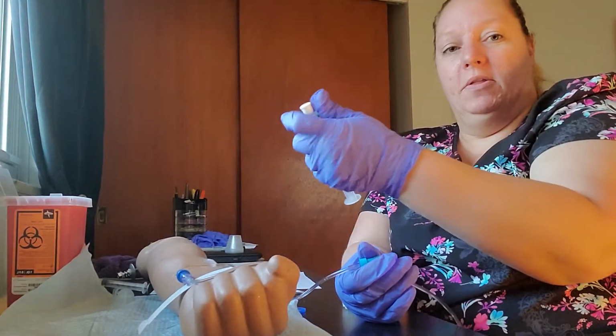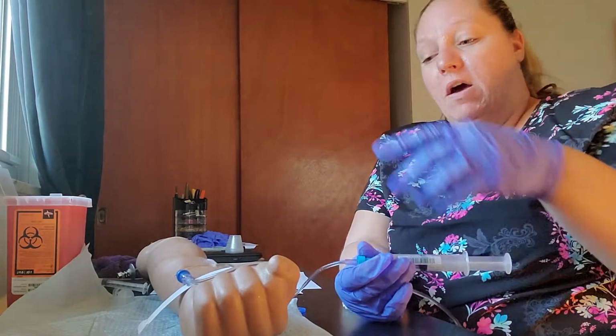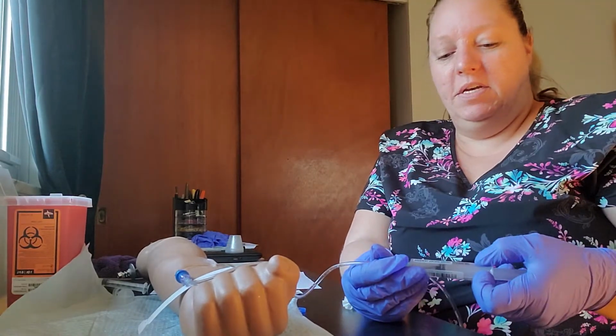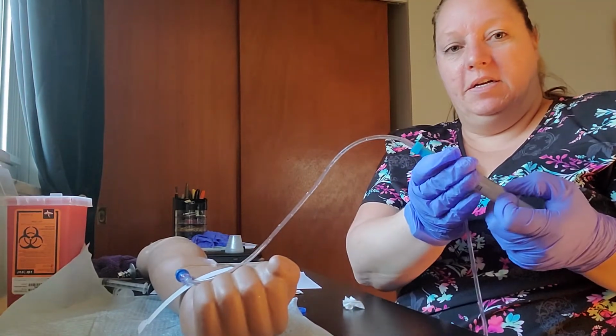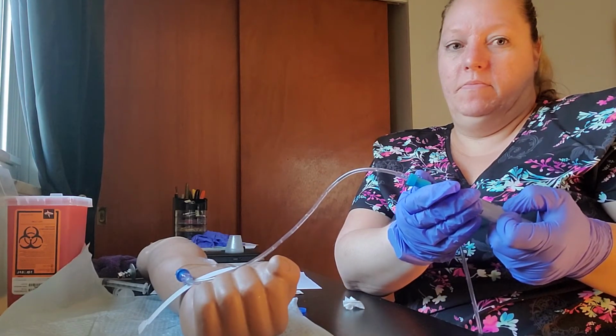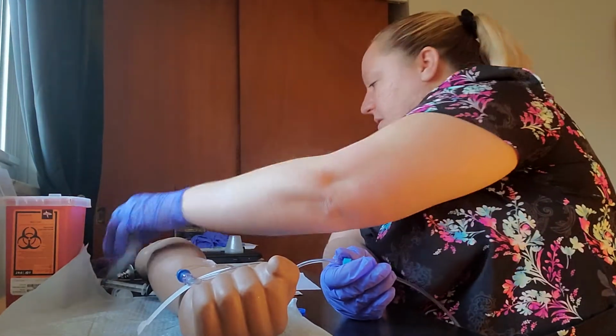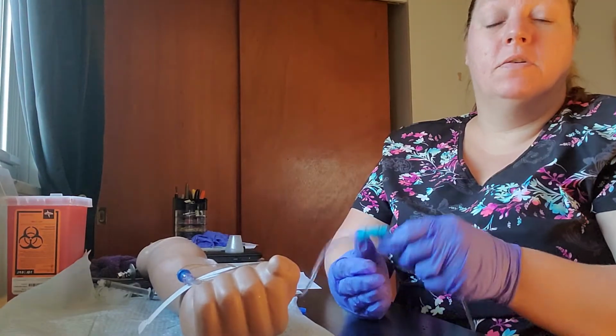I'm going to take my other normal saline flush. I let go of my line and now I'm going to flush 3 more cc's. Here we go. As you can see it going in. Okay. Once that's done, that's going to go into my sharps container as well.